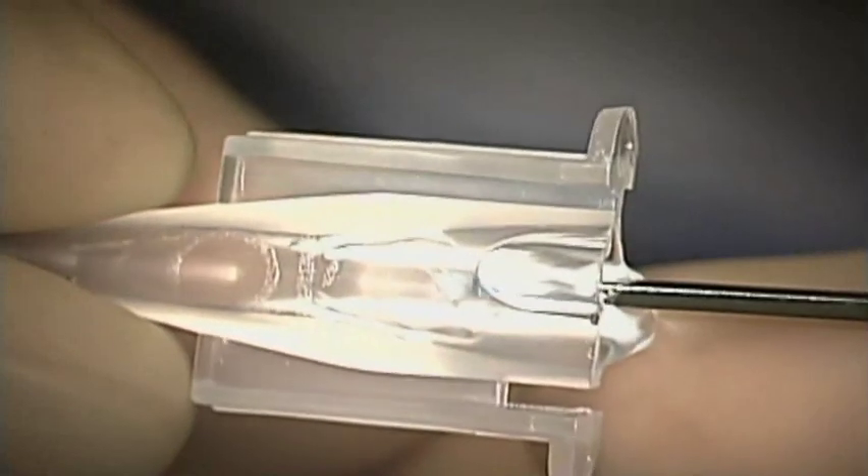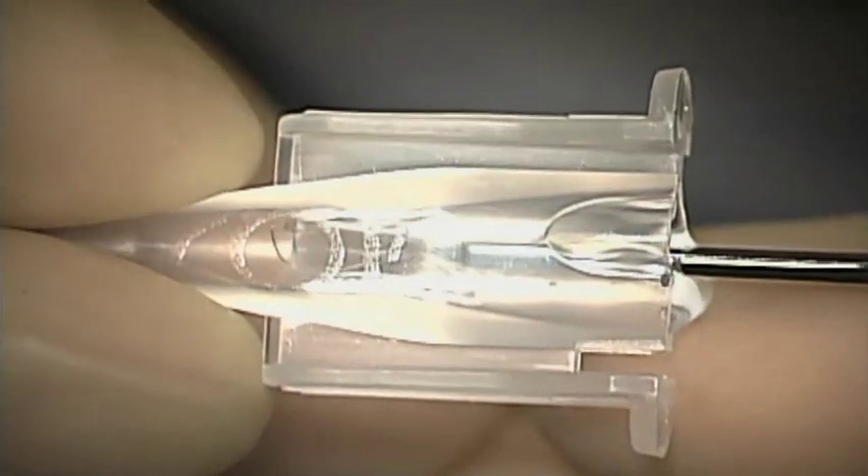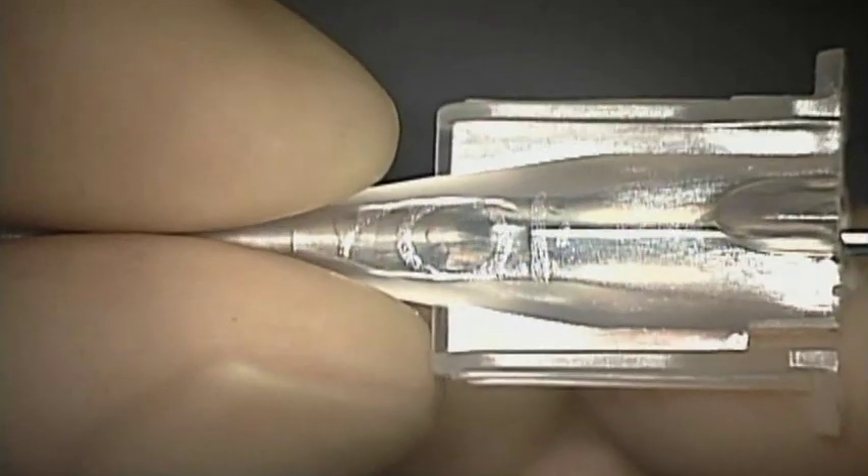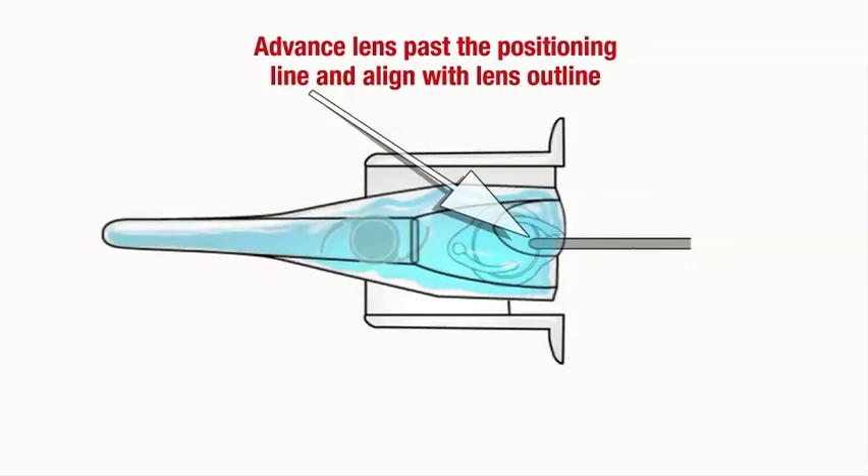Grasp the trailing haptic with forceps and tuck it over the optic body. Using forceps, advance the lens past the positioning line marked on the cartridge so it is aligned with the lens outline. Ensure that the lens and haptics remain folded in place after removing the forceps.